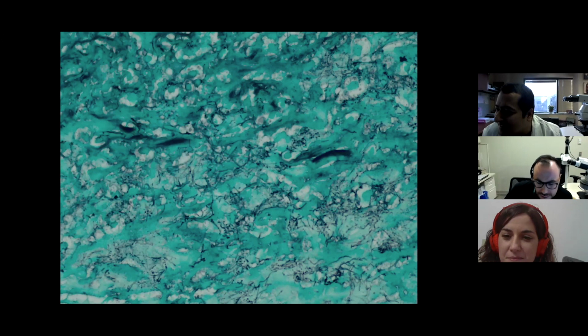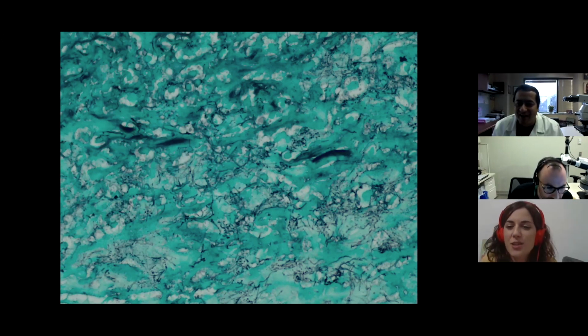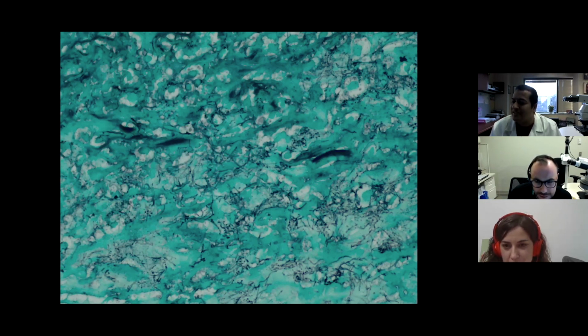Hey, show it again. I think the meatball and spaghetti image. Could be. That is definitely in the differential, but why would it be AFB positive on the smear? That's why I pulled it when I heard you. Is it an actino?